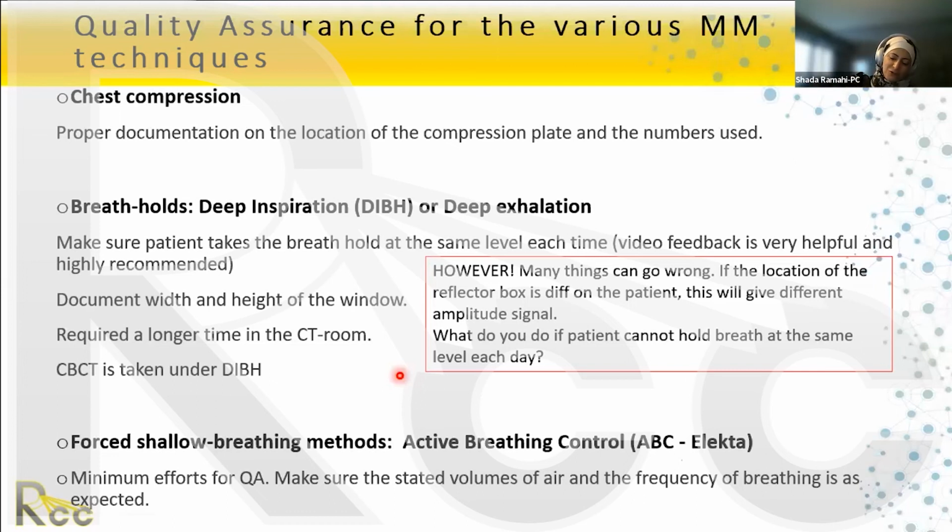Patient cannot move there. And let me tell you, from practice, it is very hard to pick up any motion on the device because the patient is barely breathing. But which is good. If I cannot pick up any motion on the device, definitely I'm less than 5 millimeter. So probably just pick up small, tiny motion.